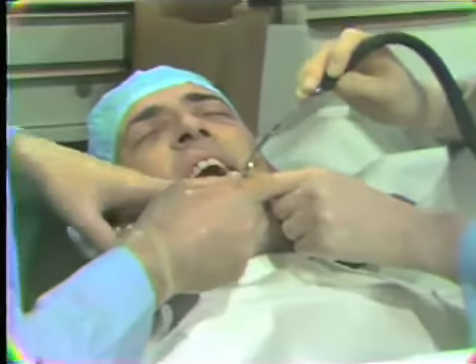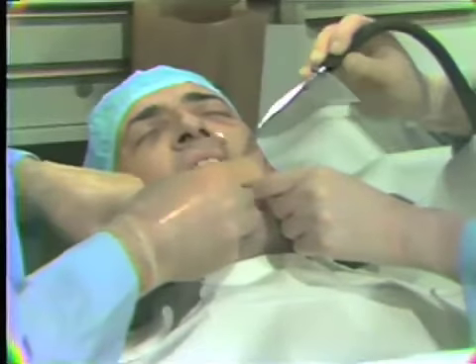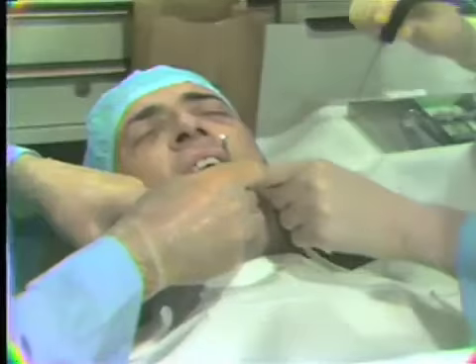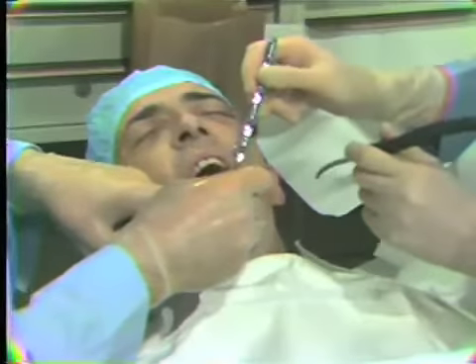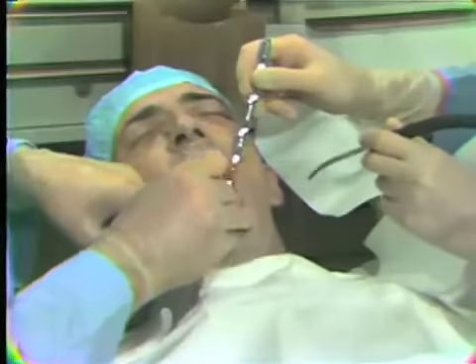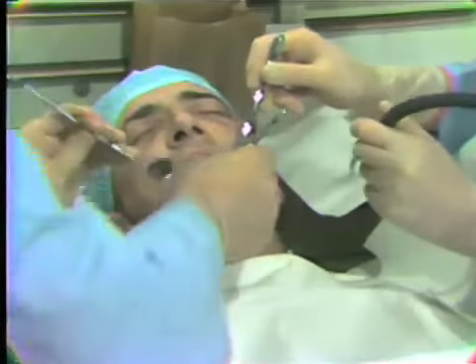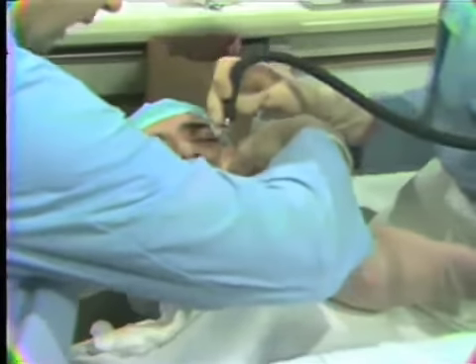There are also times when she may take a mirror and retract the patient's tongue. In working in the lingual areas, if you can take the mirror and hold underneath the patient's tongue, sometimes a very active, rigid tongue may tend to move forward into the surgical site, and with the assistant utilizing the mouth mirror, the placement of the mirror can keep the tongue from coming forward into the surgical site so that we have, again, the best visibility and access for debridement of the area.